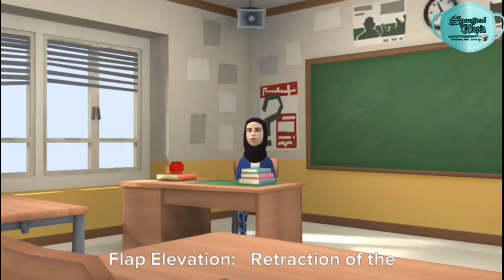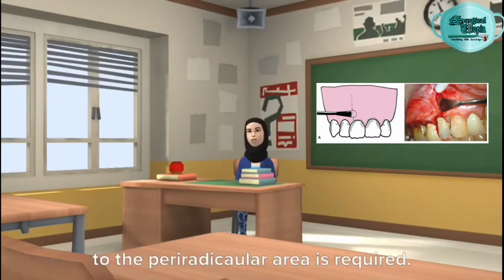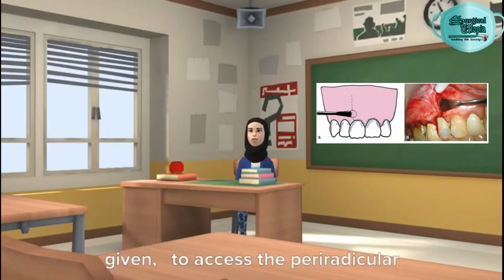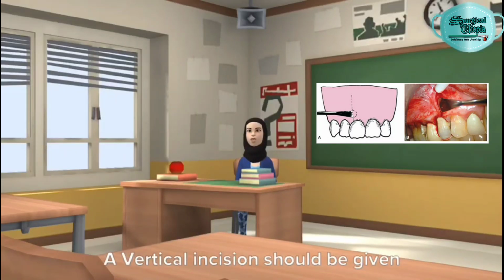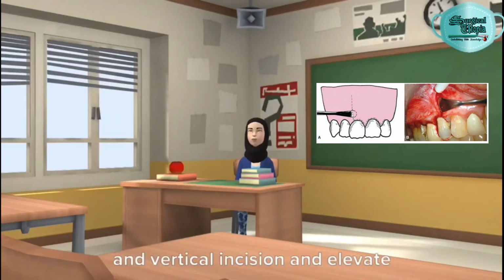Flap elevation: retraction of the gingiva or tissue to gain access to the periradicular area is required. A localized flap design should be given, to access the periradicular bone region of the tooth to be treated. A vertical incision should be given apical to the junction of horizontal and vertical incision, and elevate the flap.